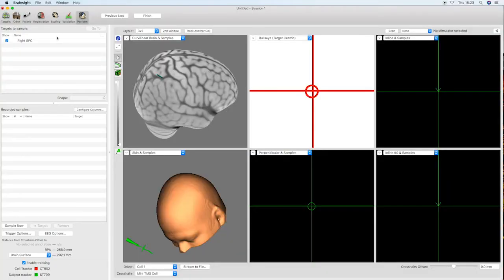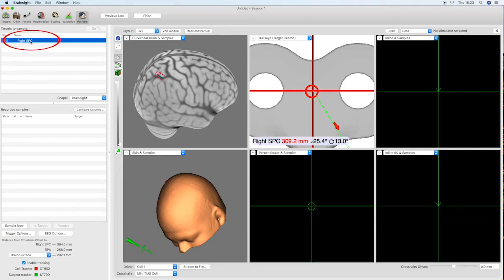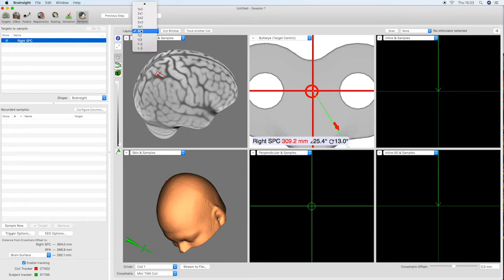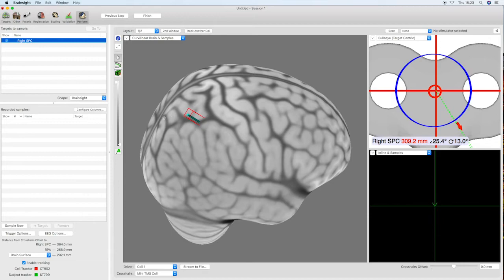After completing the subject registration we are now ready to start navigating the TMS coil to our intended target. First select the intended target in the target list in the top left hand side of the screen. This will then be displayed in the bullseye view.